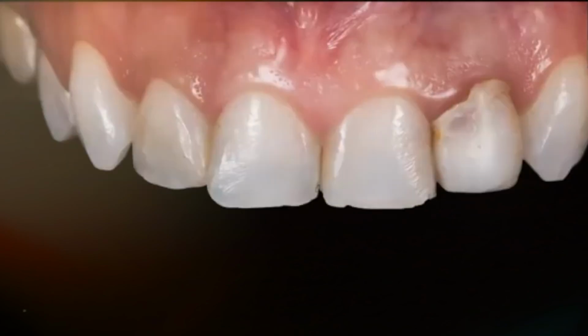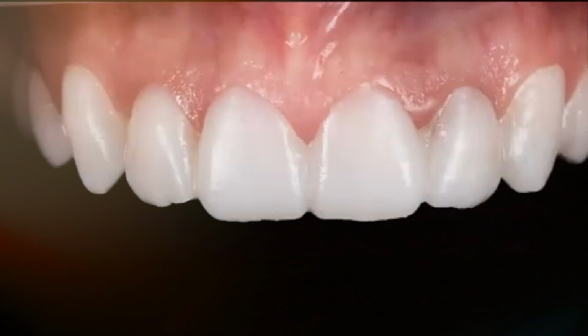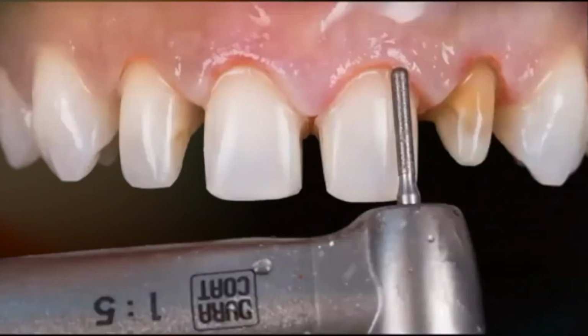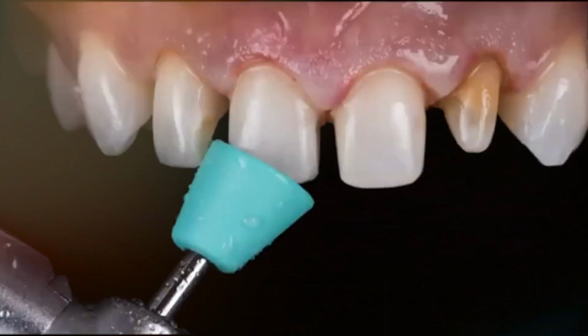So let's say we have a case like this, and here you can see we have a lateral that is dark when we remove this composite. First, like in every single case, we do design, we print it, we try it in, then we crown lengthen according to it, we prep according to it, and you see we have a dark lateral. Now, if we just do the normal stuff, obviously this lateral will have a different color than the rest. Now it's very important to understand what the color is going to result from.